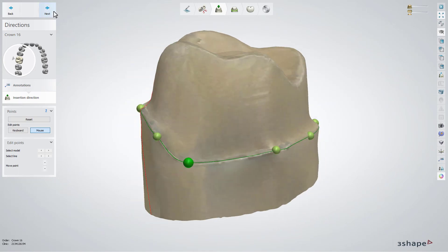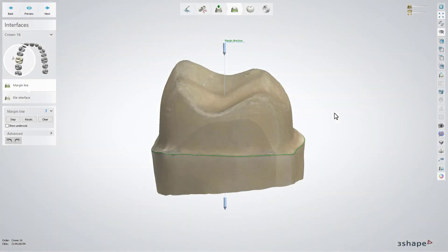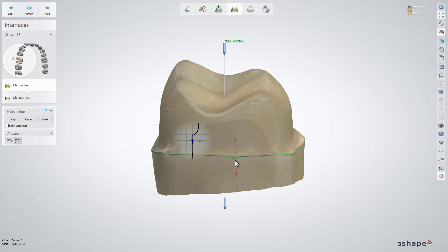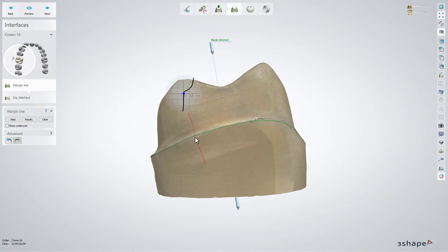Click Next to move to the Interfaces step. In the Margin Line sub-step, the green line representing the margin line will be placed automatically. It will turn red if it goes in the undercut area. Modify it easily by using the mouse cursor to draw the line or simply click to move the line on the model. The control button on the mouse scroll wheel changes the radius of the adjustment area and makes the line course smoother.